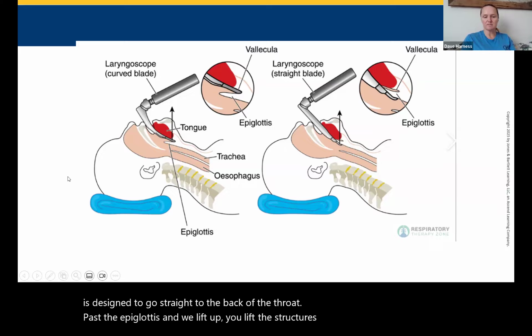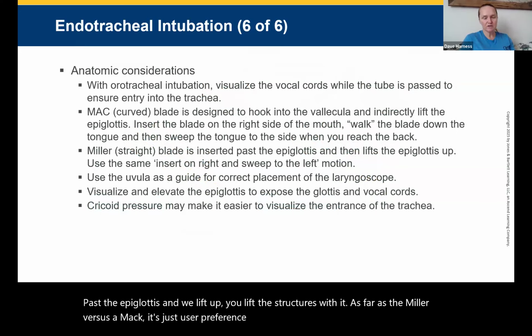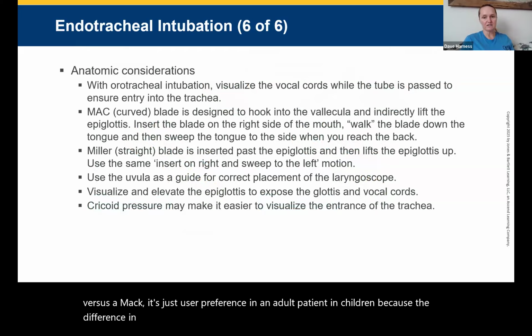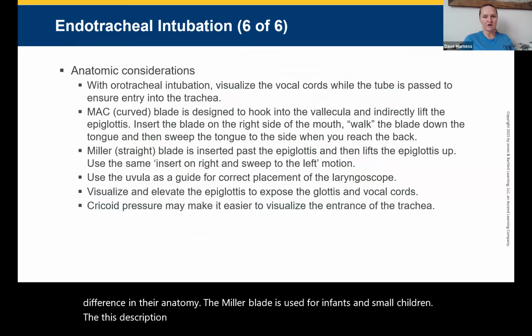As far as a Miller versus a Mac, it's just user preference in an adult patient. In children, because of the difference in their anatomy, the Miller blade is used for infants and small children. For this description of how to do this, there's another video on the YouTube channel that you really need to watch, because that guy does a great job of explaining it.